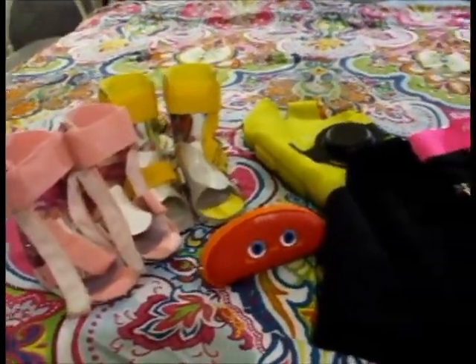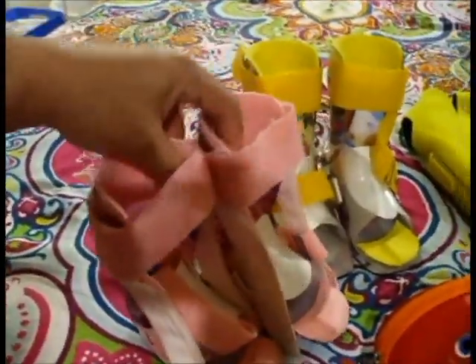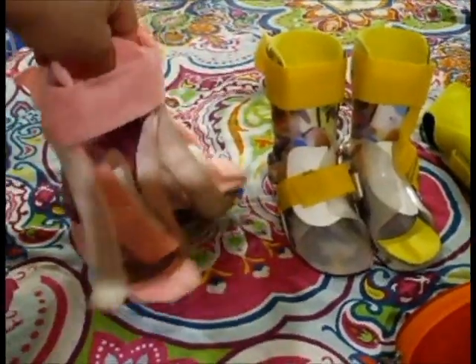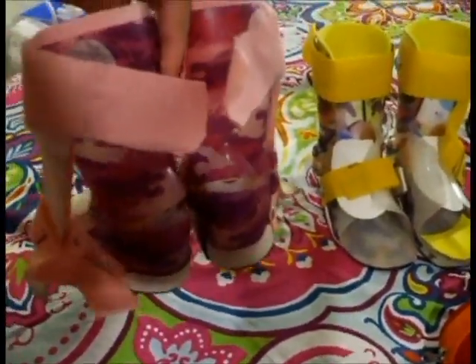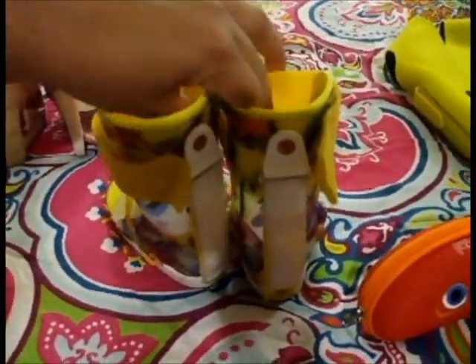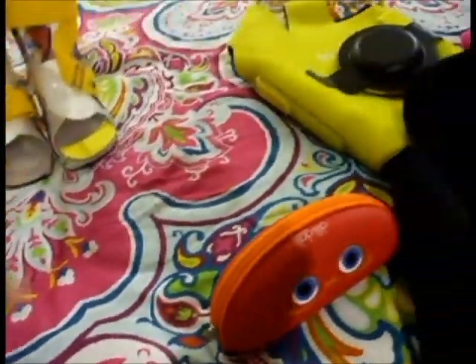This is a little bit more of her medical equipment that we use on a daily basis. These are her AFOs. This helps with her standing and being able to plant her feet. She has these two pair. These fit her pretty snug, and then these are like the next size up that we got before she transitioned out of her early intervention program. They did make them a little too big, so we are actually in the process of getting some more made that kind of fit her now.